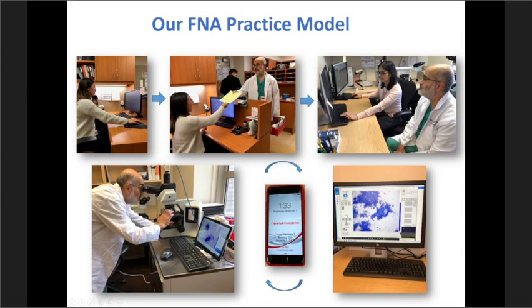And this is my colleague Abba here, seated next to Behzad, who's going to go for the procedure for adequacy assessment. And what they're basically doing is looking at the clinical information, whether that tallies with the information that was relayed initially when the call was received. Subsequent to this discussion and noting down all the details about the patient's history, which may be relevant to the case, the cytotechnologist will proceed to the gastroenterology suite. They will take the specimen, prepare the smears, and look at them under the microscope.